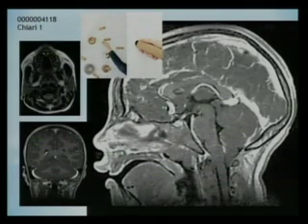Dr. Hardjasudarma, any protrusion below is Chiari 1 into the foramen magnum? What distance? Is 5 millimeters or is it? In the newborn, up to 5 millimeters below the foramen magnum is normal. In the adult, 3.5. Now, whether you're going to start calling it a Chiari when it's 4 or 3.5 depends on how fanatical you are about Chiari.